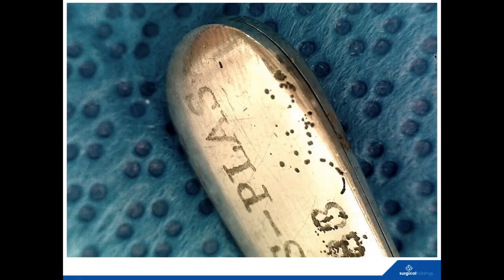And pitting is something that you see from time to time on instruments that is generally a result of some sort of chlorides in the wash water. Once the pit forms in the instrument, the chloride will attack and react with that pit, and then you'll just get this attrition on the surface of the instrument that causes this damage.